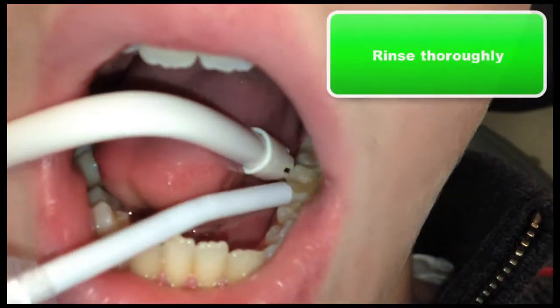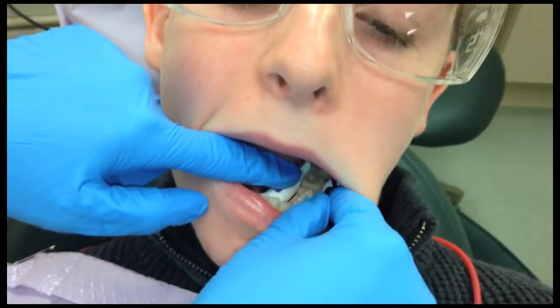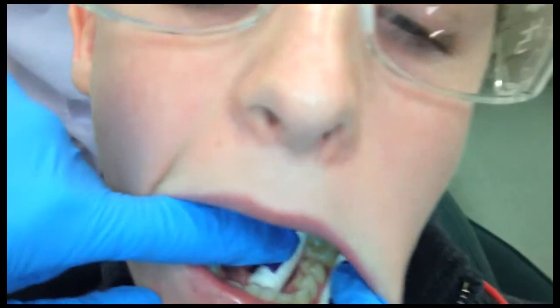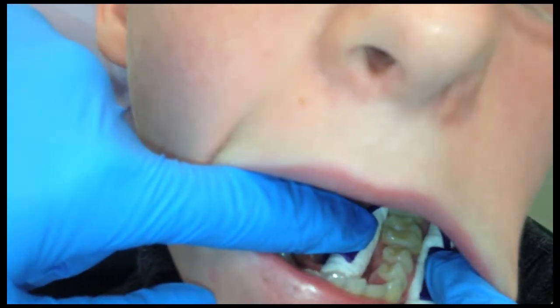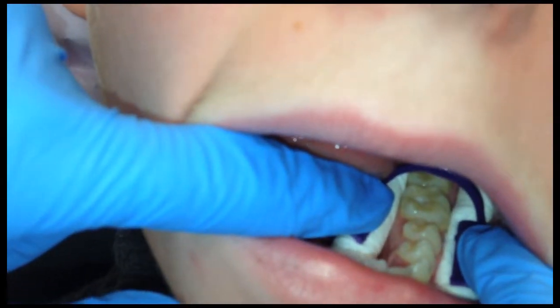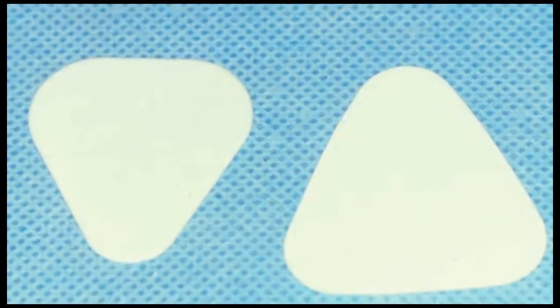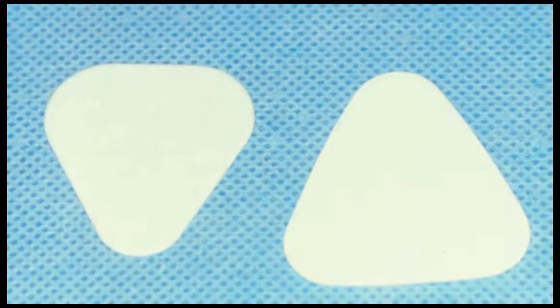The next step is to rinse the surface thoroughly. Next, place your isolation apparatus. In this video, a mandibular sealant is being placed, so we are using a plastic cotton roll holder with 2 cotton rolls. If you were placing a maxillary sealant, you would be using a dry angle.